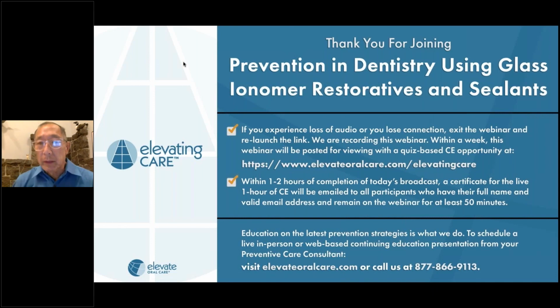I just wouldn't light cure it if you use unfilled resin to keep evaporation from occurring, because you're going to be finishing and polishing that down and removing that unfilled resin anyway. I would simply wet it with saliva or with water, but that's up to you, because if you work in quadrants, sometimes you need to coat it.